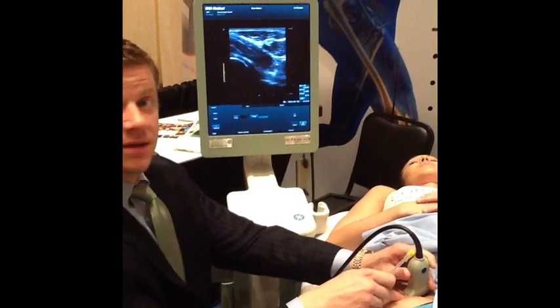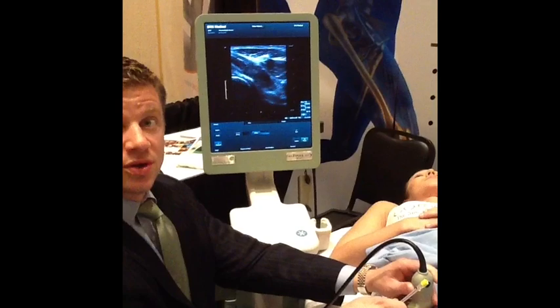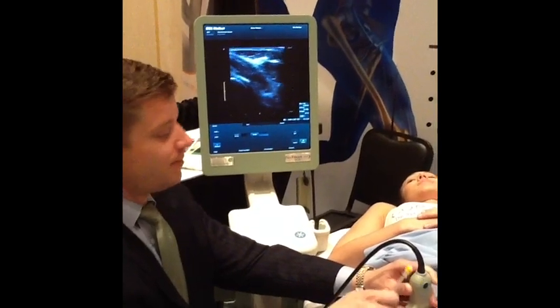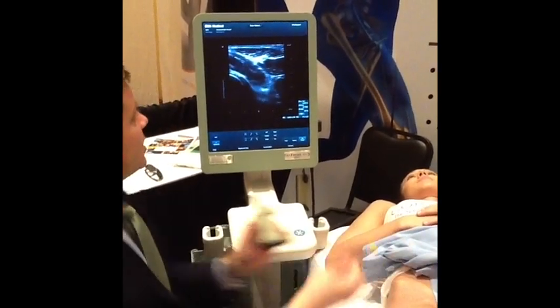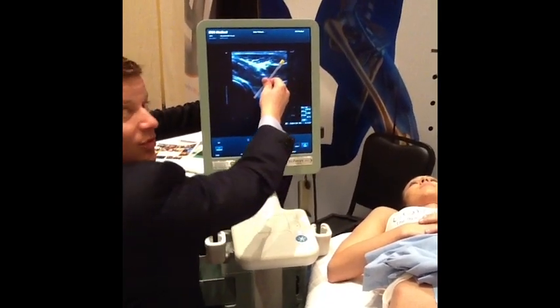You'll see where I'm pressing down where the needle would go in, and you can see in the upper right-hand corner the tissue moving. So your needle will come down like this, right where you want it.